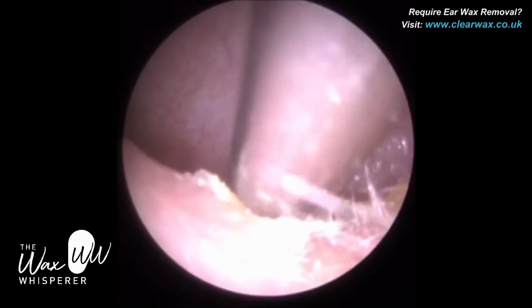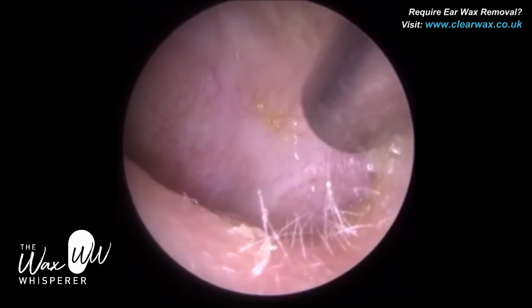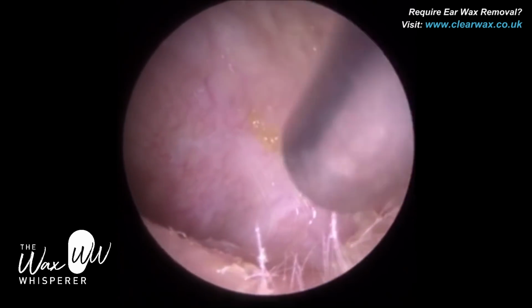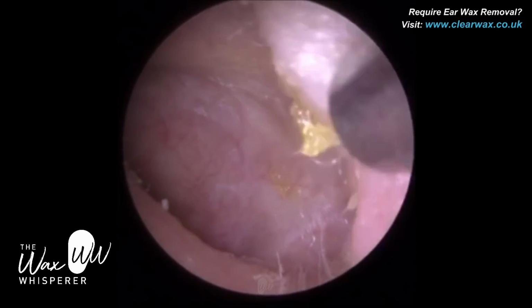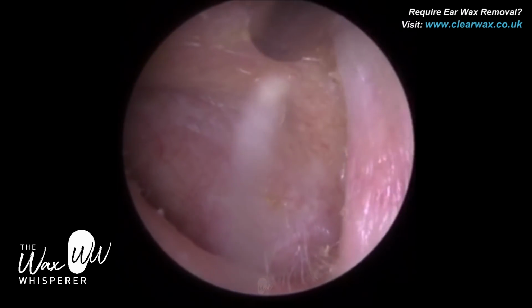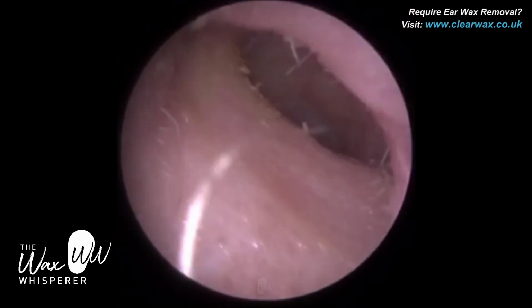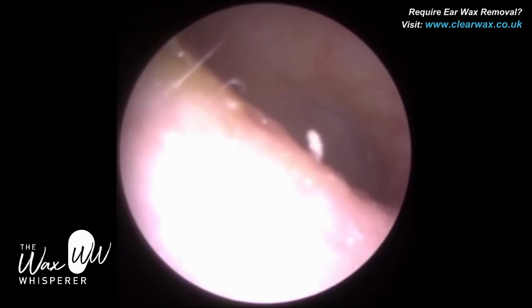So you can see how bendy the ear canal is. You can't see the eardrum there. I'm just looking straight into the ear canal with the endoscope and I'm seeing the back part of the ear canal. I think this is the second bend, almost 45 degrees, I would say. So it's a very prominent bend. But with an endoscope, if you've got the correct skill, you're able to mitigate that and work around corners and bends. Yeah, it's very pronounced actually. I didn't realise how bendy the ear was.